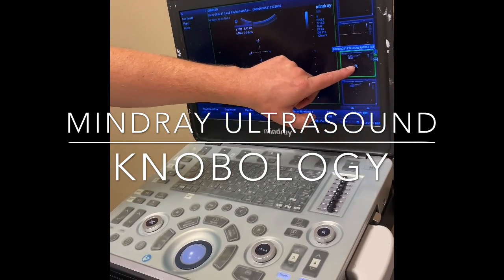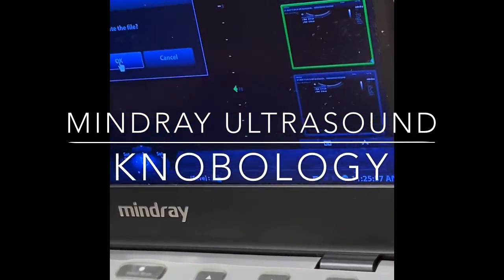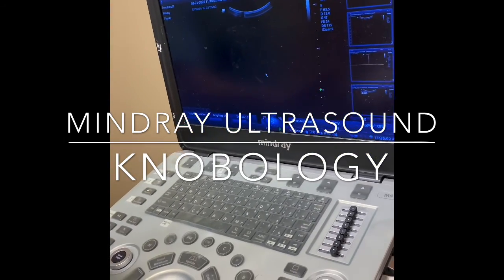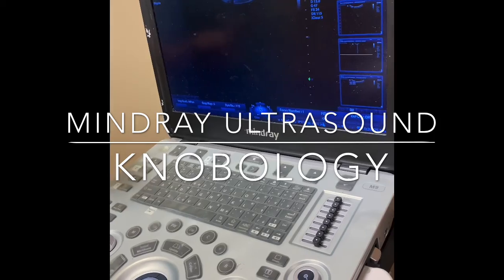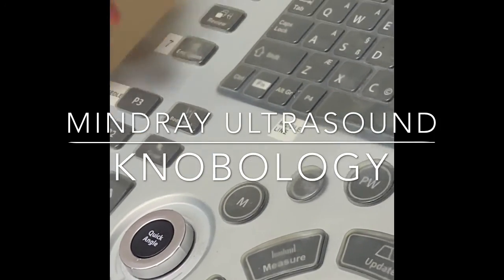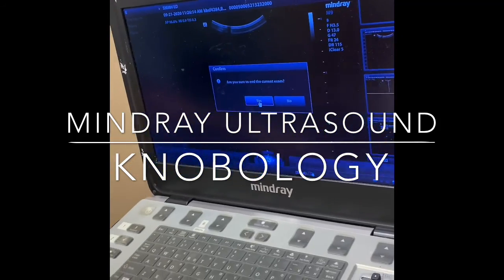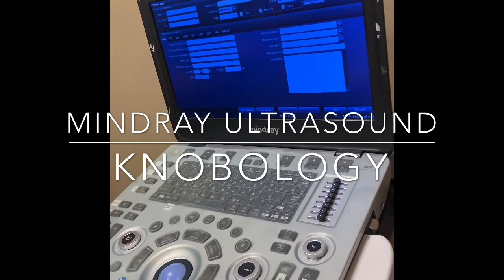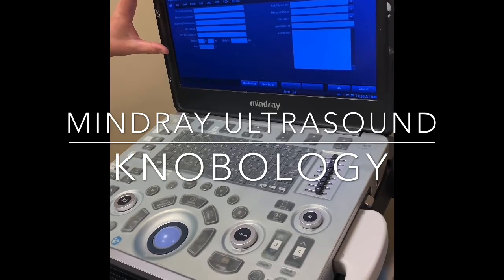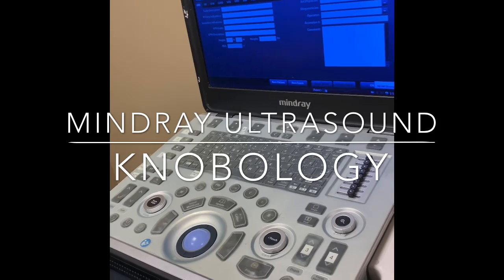When you select a thumbnail, there's a trash can in the corner, and you could delete it from the study right here. Then I get a prompt and I say okay. When I'm done scanning, I have to remember to press the End Exam button. When I press End Exam, I get a prompt confirming that I'm sure that I want to end it, and I click Yes. At this point, the image is automatically being transmitted to QPath, and we go back to the patient screen here. Now you're ready to start over again and scan the next patient.